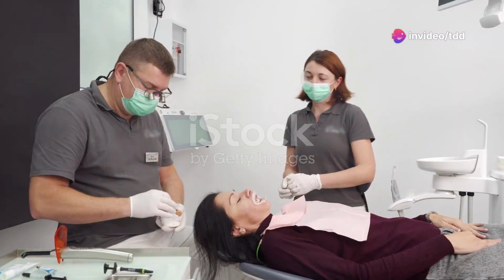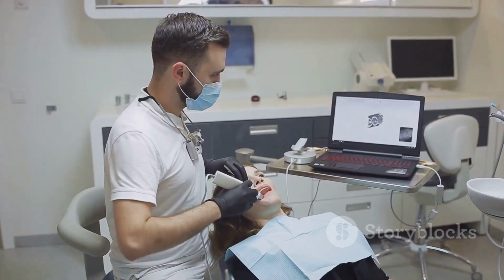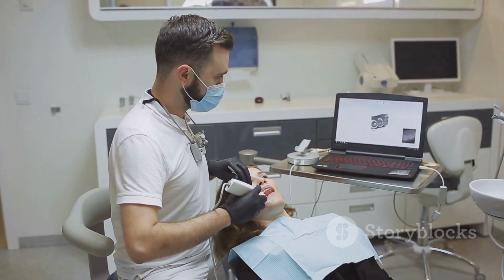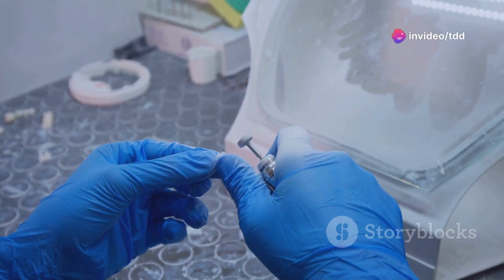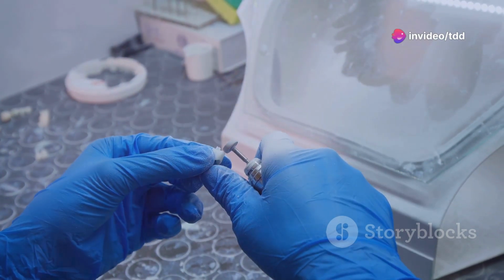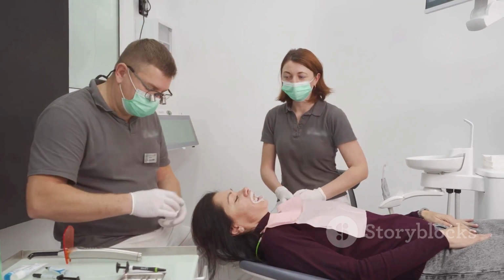Step 6. Final restoration. Finally, we create and place the crown. This step involves 1. Taking impressions, either digitally or with a traditional tray. 2. Fabricating the crown in a lab or milling it in-house. And 3. Attaching the crown to the abutment using cement or a screw-retained method.